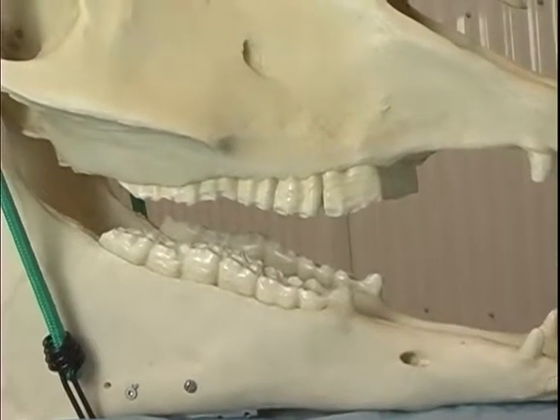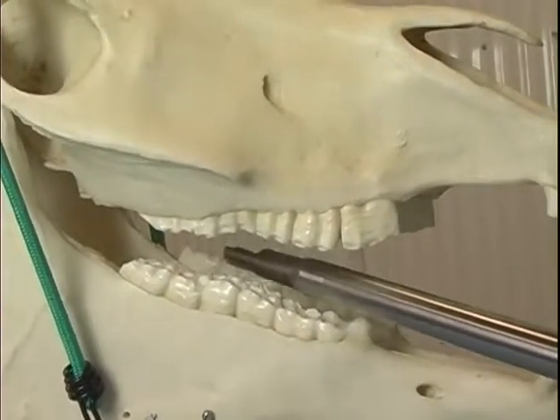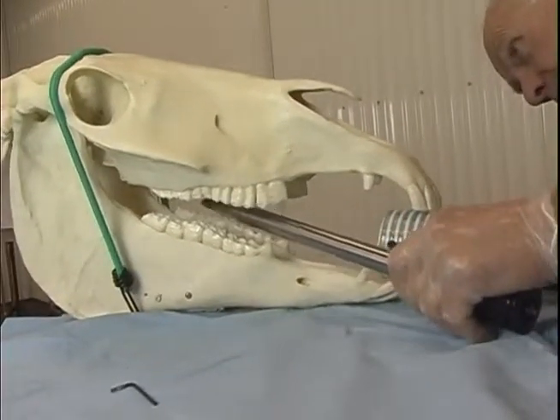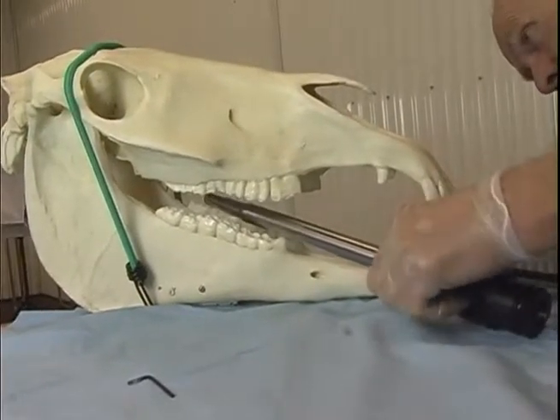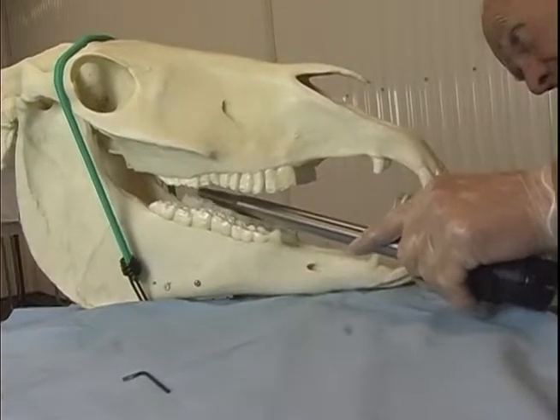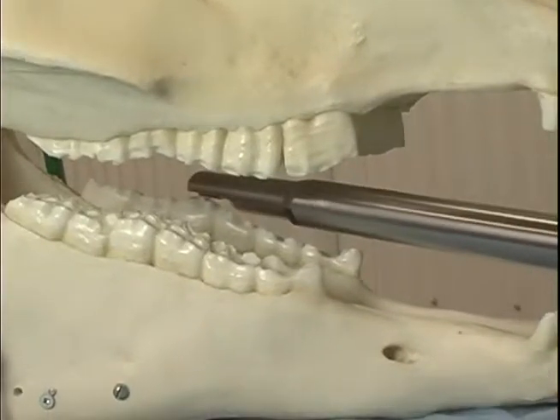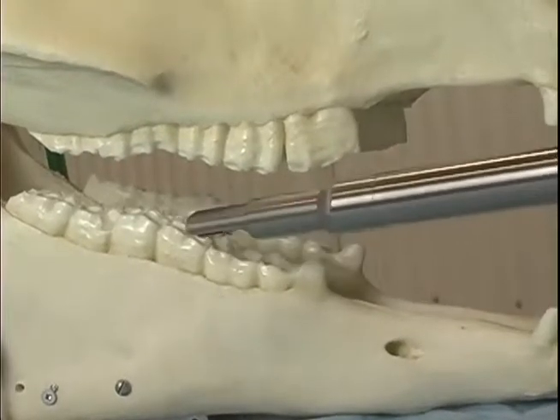From that angle, of course, from this side, you would be going in like this, diagonal across the mouth to get to the back. The guard pushes it out, you can get the sharp enamel points, plus you can float off any tall points on the occlusal surface. And of course you spin it to get the inside on the lowers, and you can take off the hook on the back and float the last two teeth that are not very accessible. Once you get to this area here, this whole area from the third or fourth cheek tooth back is accessible with the right angle tool.